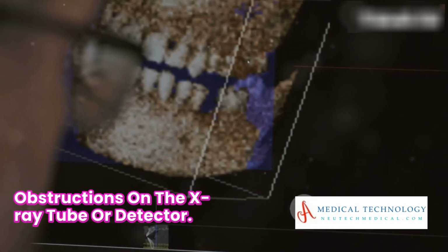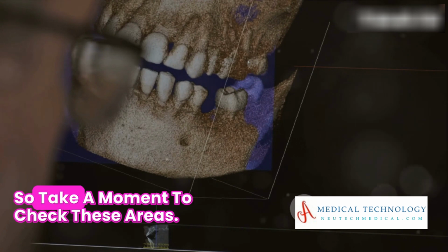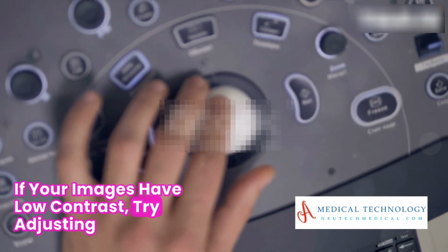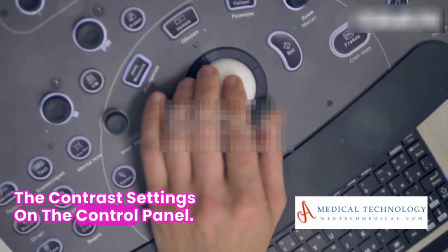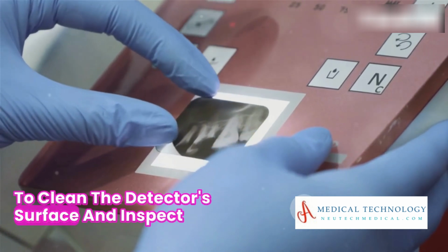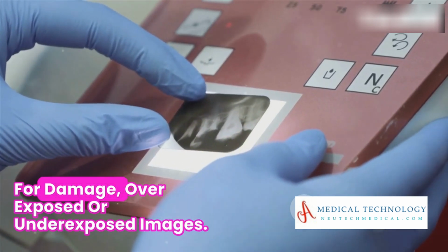Now onto image quality issues. Blurry images can often be a result of obstructions on the X-ray tube or detector, so take a moment to check these areas. If your images have low contrast, try adjusting the contrast settings on the control panel. Artifacts on images often indicate the need to clean the detector surface and inspect for damage.